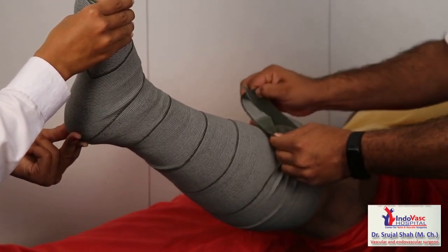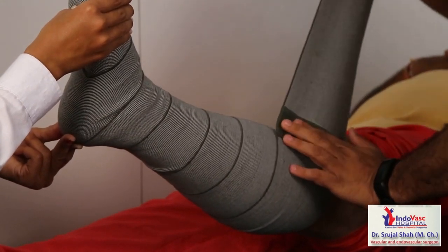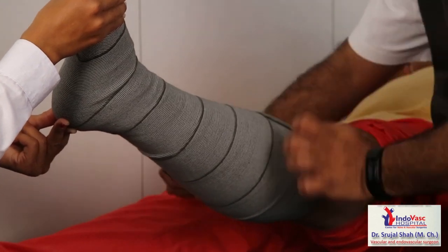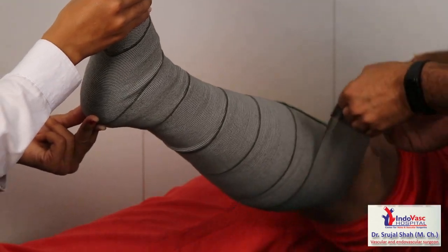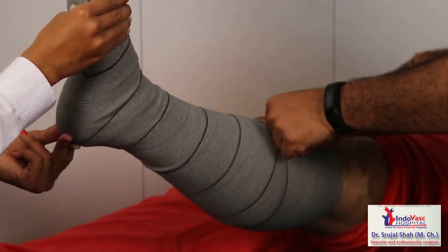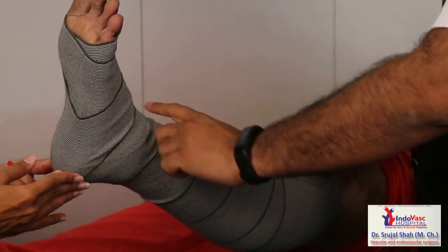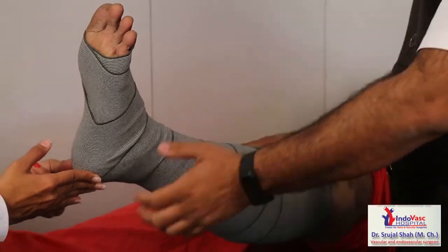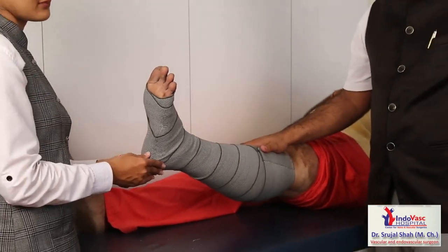There is a velcro here — the main advantage is you don't have to apply safety pins or clips which patients usually lose and then don't apply the bandage. The last round is done like this. After applying, we ask the patient to wait 10 minutes, walk around, and if there is too much pressure we may loosen it. If the patient feels a lot of pain, we adjust accordingly.